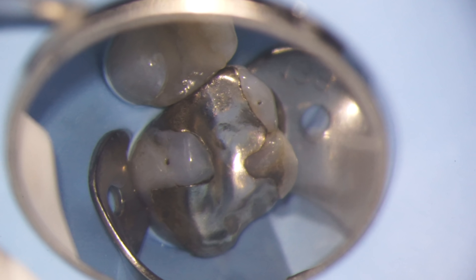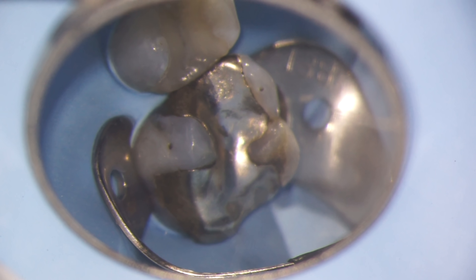When a silver filling begins to leak or there's decay underneath, we need to make sure we remove it in order to solve the problem.